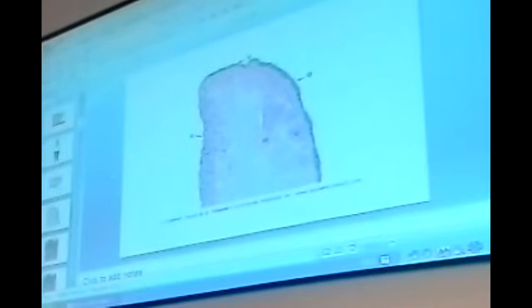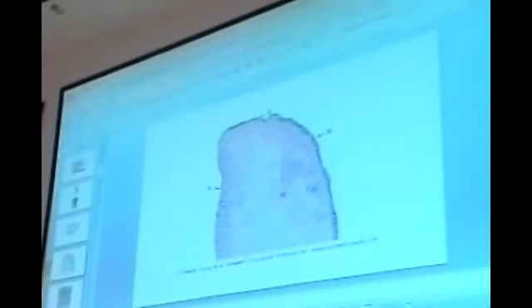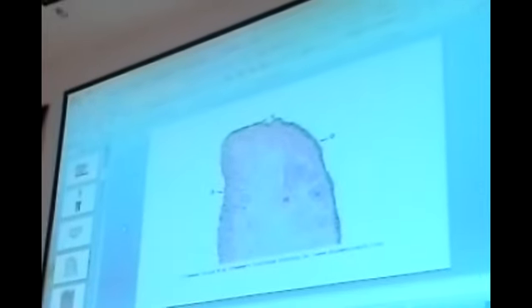Okay, what is this structure? It is covered from outside by thin skin provided with hair, hair follicles and skin glands, and lined from inside by mucous membrane with glands in the submucosa. The core of the lip is formed of skeletal muscle fibers centrally arranged, the orbicularis oris. What is in between the mucosa and the skin? This area which appears red is called the red margin, or vermilion area.